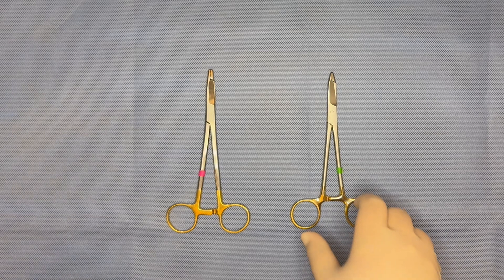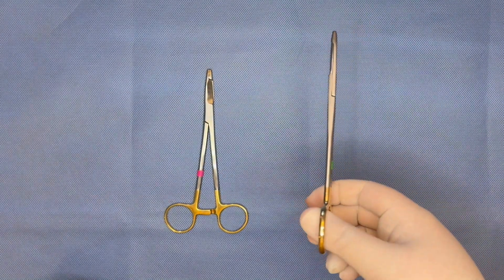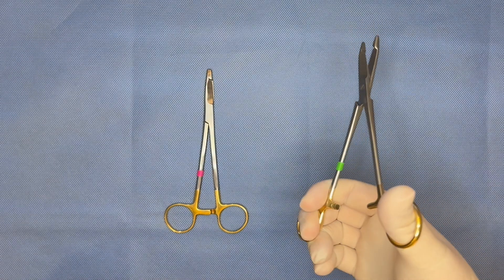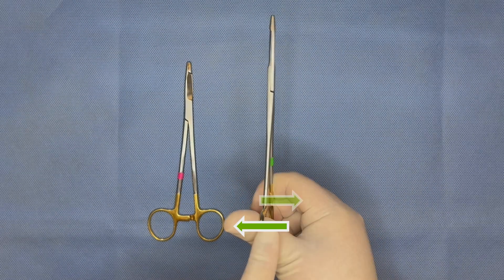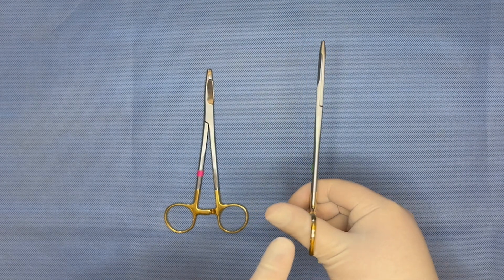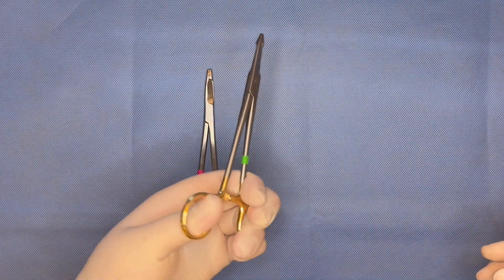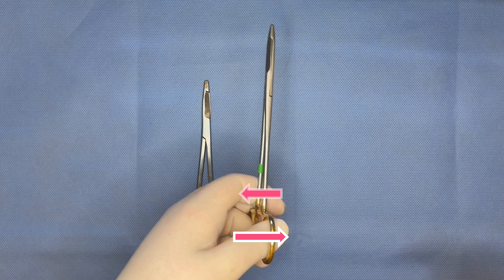Standard surgical instruments are designed for maximal efficiency when using a right-handed grip. A gripping motion includes a pushing force from the base of the thumb and pulling of the fingers towards the palm. Both scissor blades and the box locks of hemostats and needle drivers are oriented such that these natural forces act to push the blades against each other or open the box lock. You can see that when I switch the needle driver to my left hand, my natural gripping motion no longer opens the box lock because the forces are working to push the lock closed.